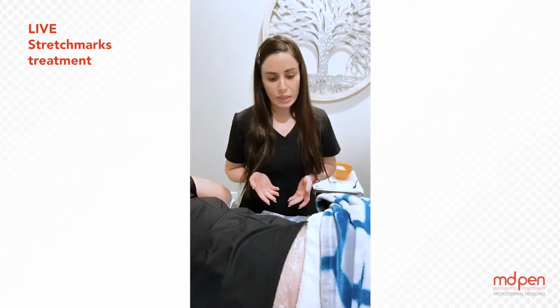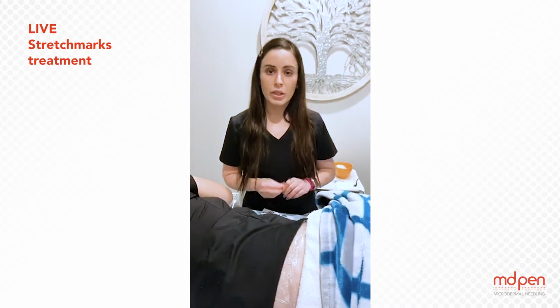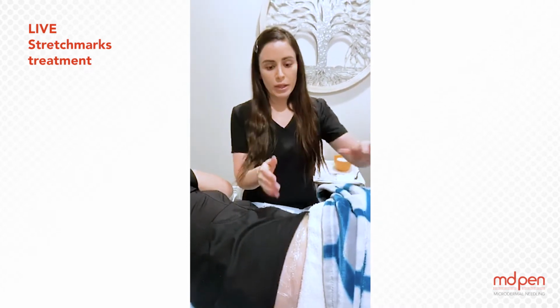My model today has never been treated, and I'm hoping you guys will be able to see she has a combination of old stretch marks, which are white, as well as some new stretch marks. Right now she's been on the losing end of losing weight. She is 24. She had an abrupt growth spurt in her early teen years, which is where the majority of the stretch marks came from. Today we'll be working with her hips.